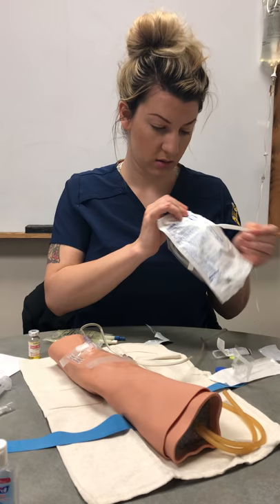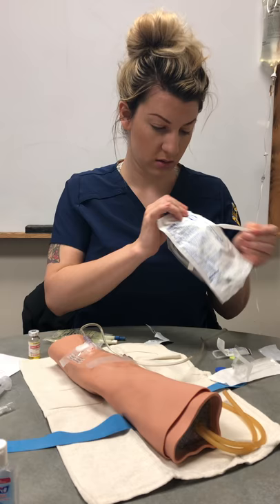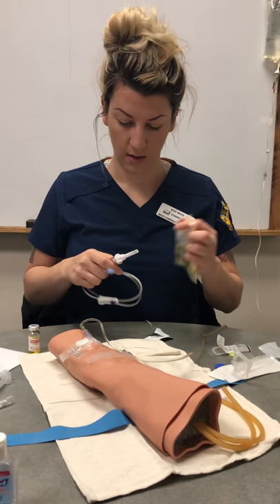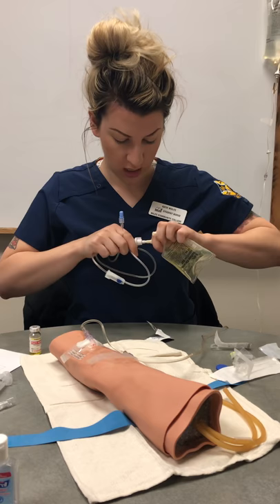We have a secondary medication set, so we're going to use a little trick. Close the roller clamp, and hook that up.